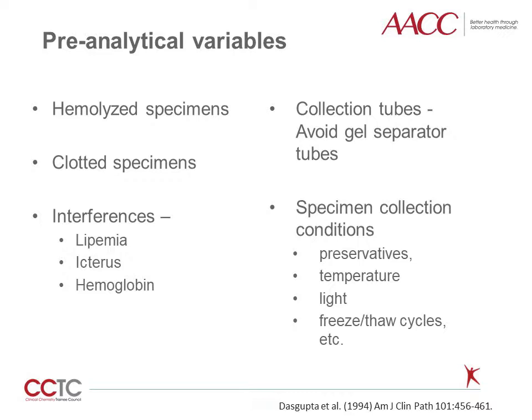components after centrifugation. Serum separator tubes can affect drug concentration because of adsorption of drug into the gel after prolonged contact. The adsorptive effects can vary among drugs and have been shown to significantly reduce the drug concentration. Therefore, separator tubes should be avoided. The stability of drugs after collection also may vary and can be impacted by collection tube preservatives, temperature, light, freeze-thaw cycles, and interferences such as lipids, bilirubin, and hemoglobin. Therefore, pre-analytical factors can impact the accuracy and precision of TDM results.